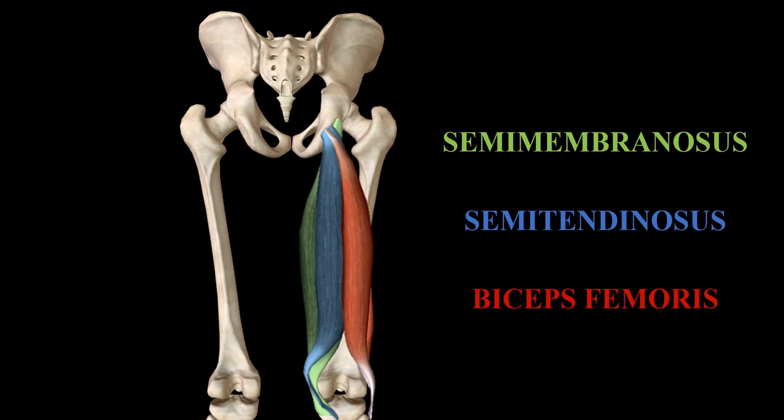So if we place a single EMG sensor in the middle of this muscle, as we're supposed to, the middle of the muscle belly, how can we be certain that we're getting the activity of the whole muscle? Because we've just got this sensor placed in the middle. And there are some studies out there that have, for example, let's go with the biceps femoris, that have placed two EMG sensors, one higher up or proximally and one lower down, distally, both on the biceps femoris, and compared the activity between the proximal and distal regions of that muscle.